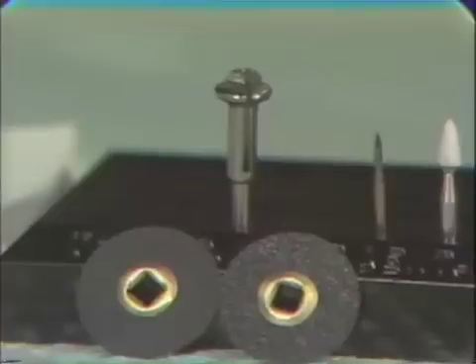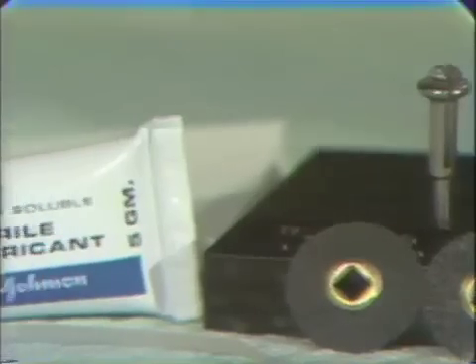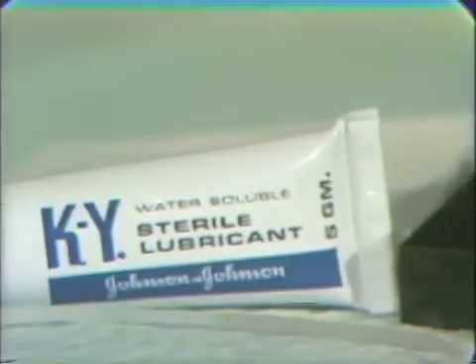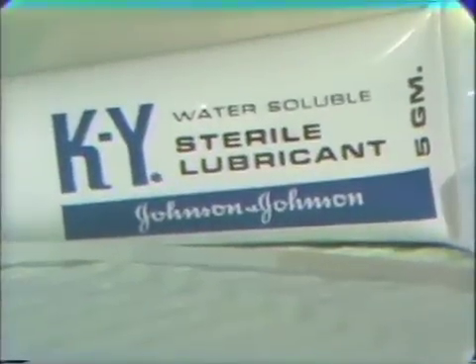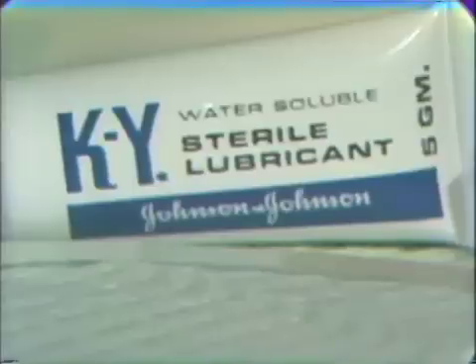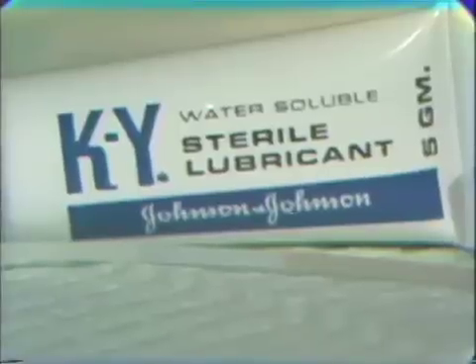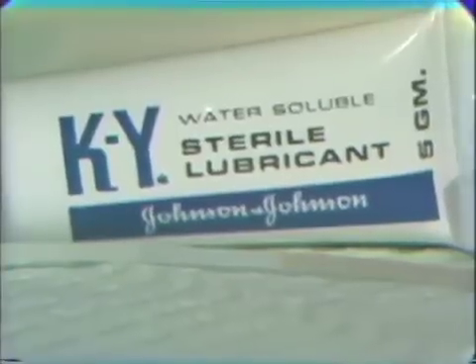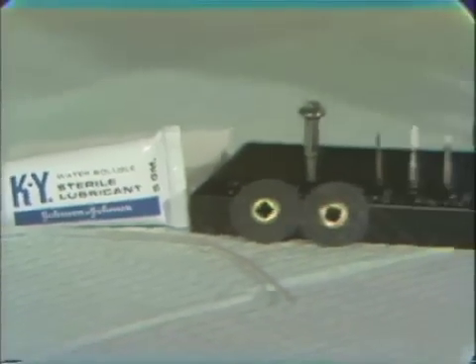Now at the end we see a mandrel for our sandpaper discs. These are waterproof discs. The one on the left, of course, is fine. The one on the right is coarse. And we use the KY sterile lubricant jelly, water soluble, for our polishing with the discs. There is a strip, as you can see, at the bottom of this sterile lubricant tube. It has a coarse grit on the right, an open space in the middle, and a finer grit on the left.